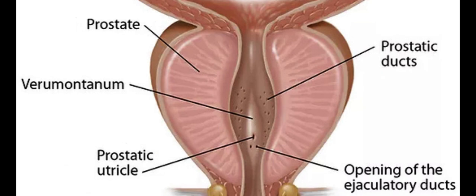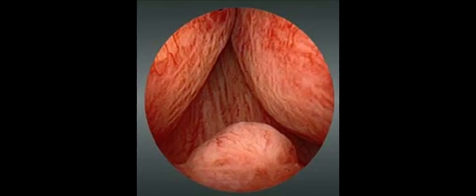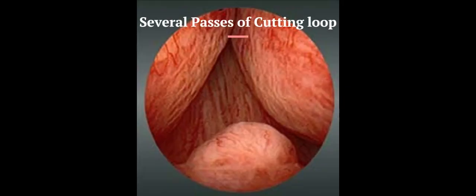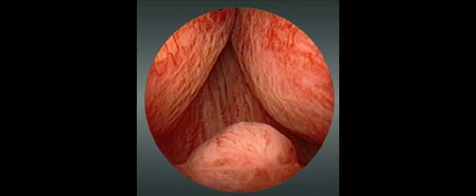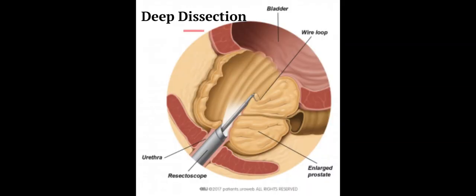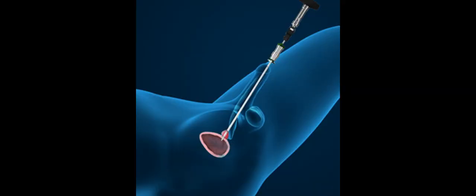The resection is performed with pure cutting current to minimize cauterization of the delicate ejaculatory ducts. Often, several passes of the cutting loop are required to visualize the ejaculatory duct openings within the prostate. This can mean relatively deep dissection in a small prostate gland, a situation that can make even an experienced transurethral surgeon feel uneasy.